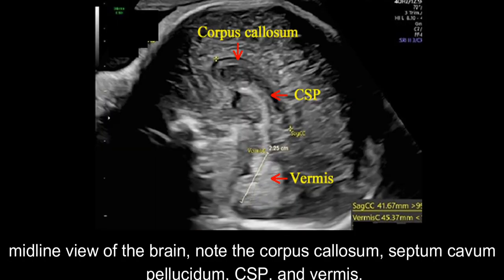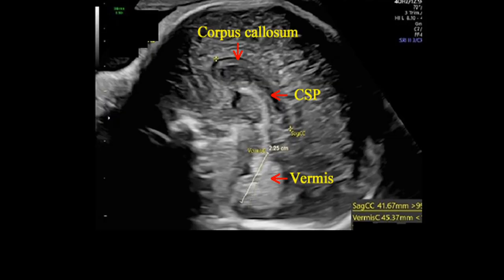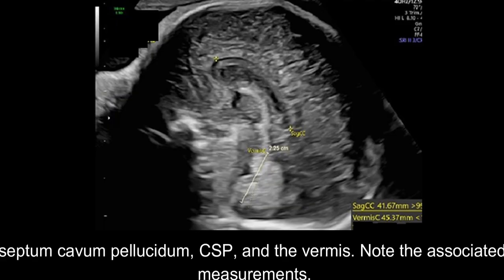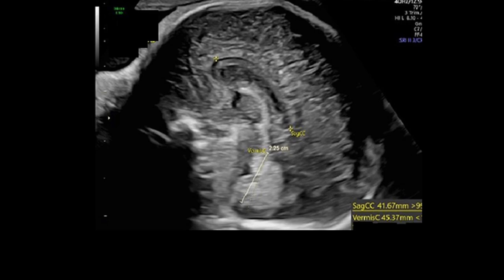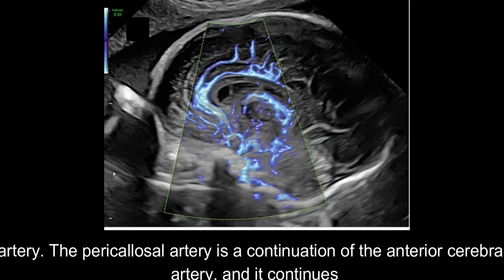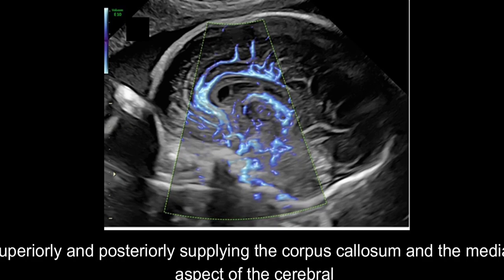In this sagittal midline view of the brain, note the corpus callosum, cavum septi pellucidae, CSP, and vermis. This is another sagittal midline view of the fetal brain demonstrating the corpus callosum, cavum septi pellucidae, CSP, and the vermis. Note the associated measurements. The sagittal midline view of the brain with color Doppler demonstrates the pericallosal artery. The pericallosal artery is a continuation of the anterior cerebral artery, and it continues superiorly and posteriorly supplying the corpus callosum and the medial aspect of the cerebral hemisphere.